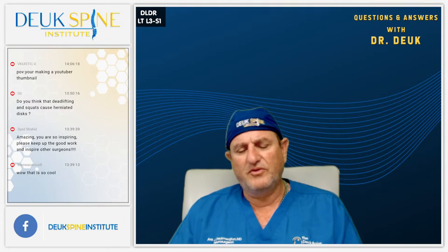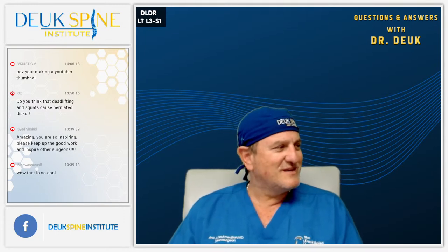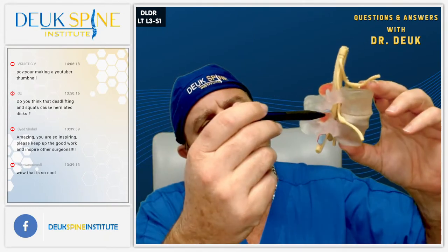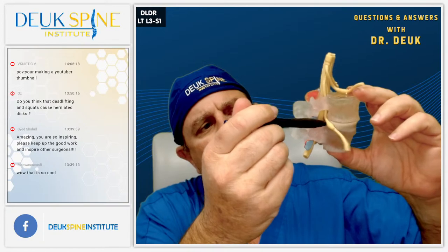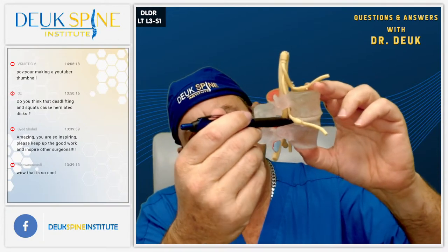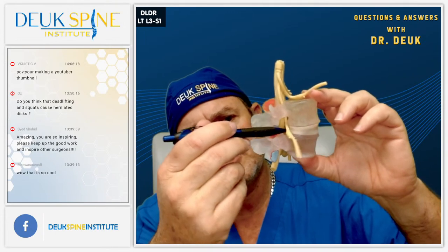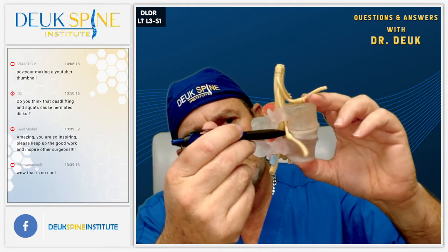That said, the laser surgery part went beautifully. Henry and I got some amazing pictures. We don't always get to see the nerve root, okay? But just so you understand what I'm talking about, this is the view right here. We're inside the disc right here. And what I did was pull the tube back out of the disc and give you a little view of this nerve root right there, just the corner. So you could see the herniation where it was, the disc, and then the nerve root. So you could see the hole where the herniation was.